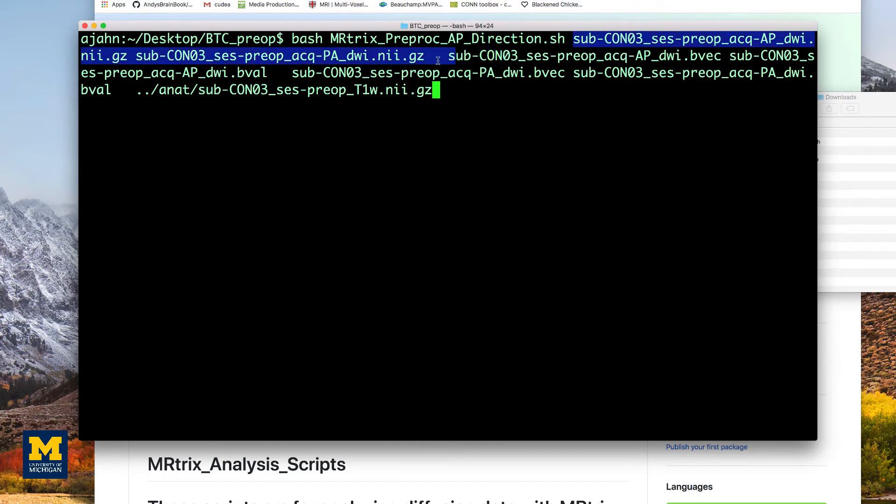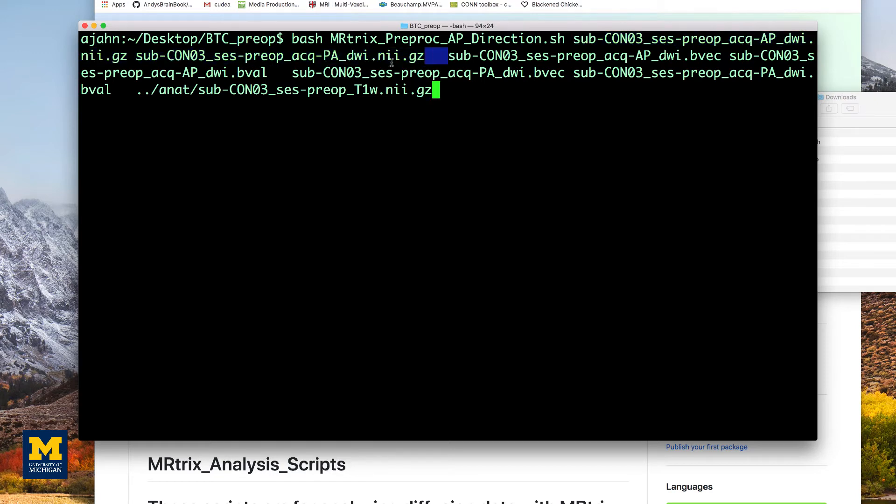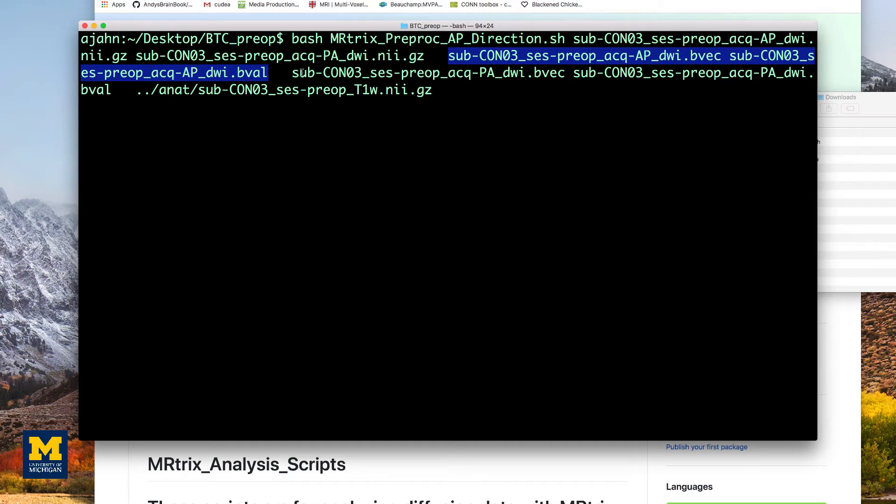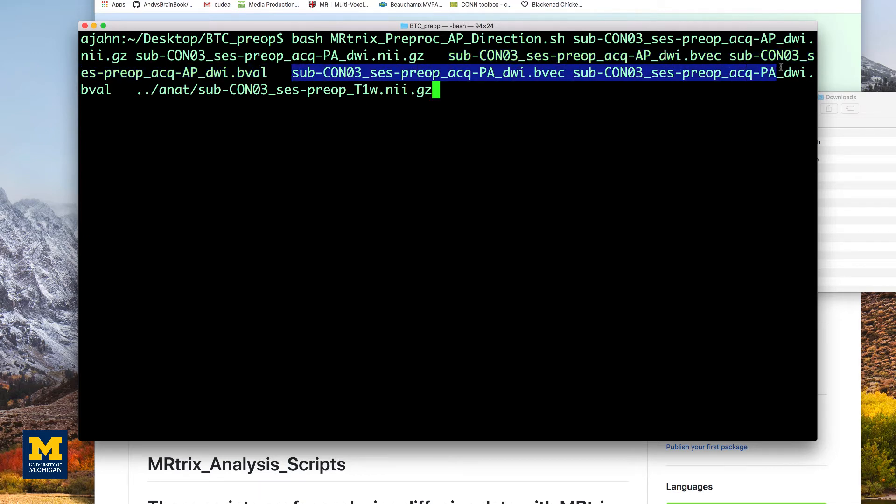The first two arguments specify the primary and reverse phase encoded images. The next four arguments point to the bvec and bval files for the primary and reverse phase encoded images, respectively.